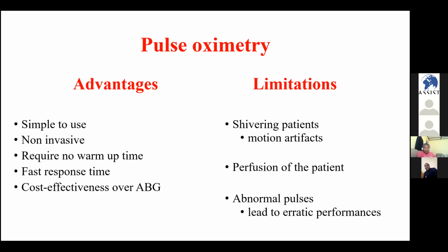So regarding the advantages of pulse oximetry, pulse oximeters are incredibly basic tools that are very simple to use, and they are non-invasive, and they are ready to be used whenever the batteries are charged.